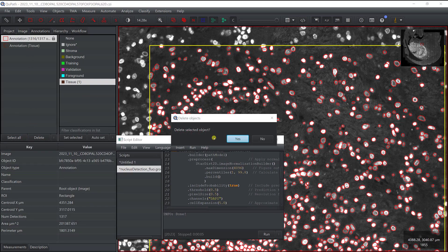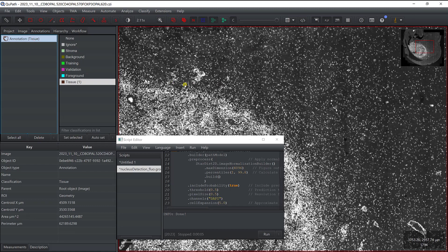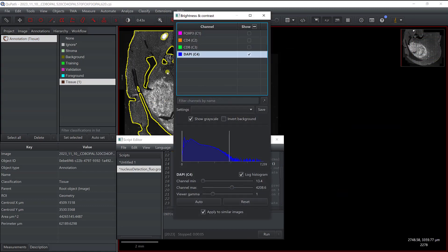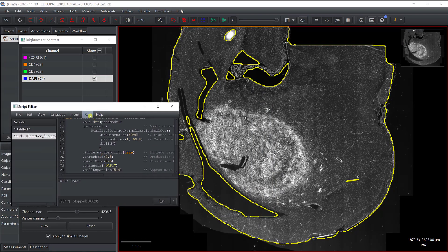With the parameters optimized, I'll remove the test annotation. It asks whether to keep the descendant objects — the nuclei are descendant objects of this annotation in QuPath's hierarchy — and I say No to discard them. Now I'll select my entire tissue annotation and run the script on the full image. I'll speed up the video so you don't have to wait for the full processing time.